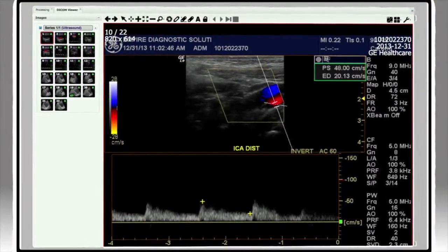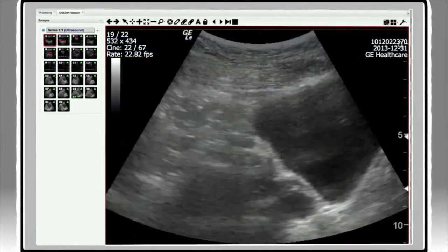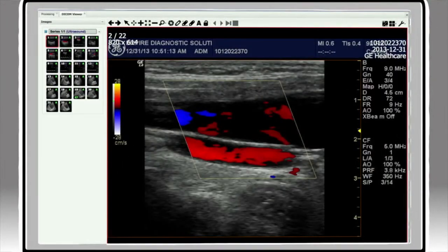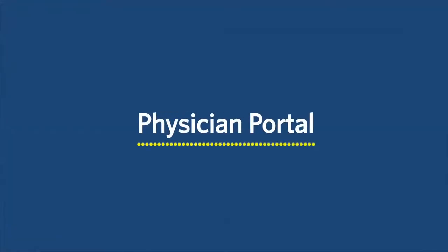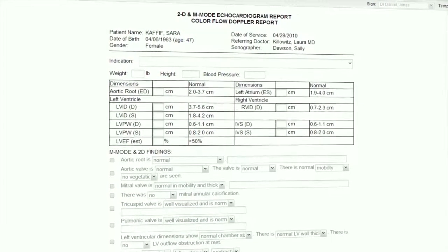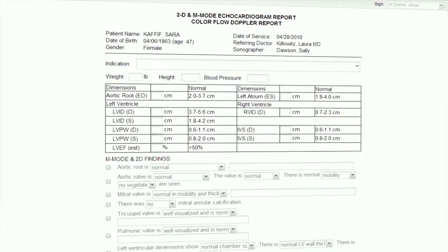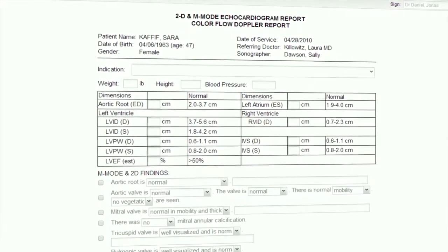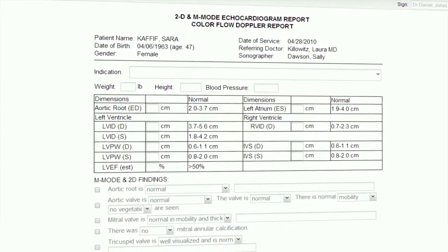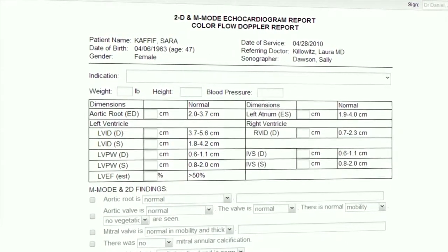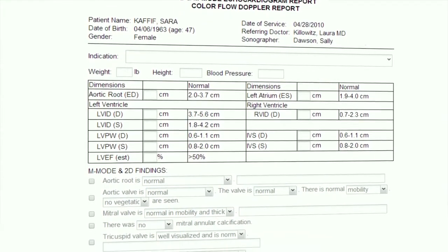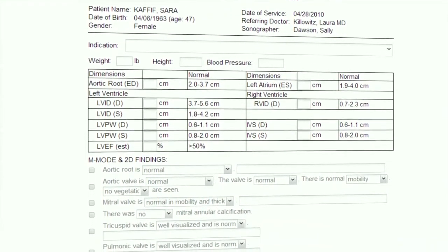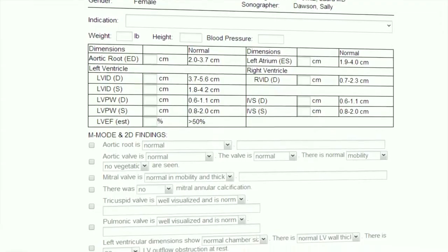All test images are managed by the built-in PAC system, where reading doctors can also view images via our DICOM viewer. Here referring doctors and your reading doctors can access patient-related files 24/7. Referring doctors can review final reports and your reading doctors can easily create reports using our structured template system.